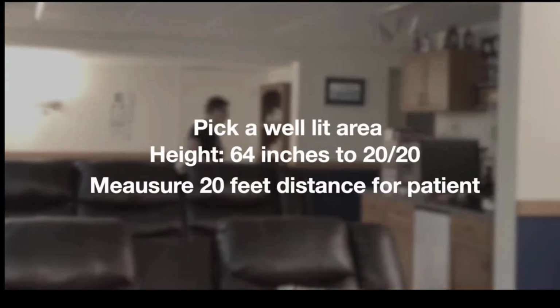Now you want to pick a well-lit area. The height of the Snellen chart is 64 inches to the 20/20 line, and you want to measure 20 feet back for your patient to stand.